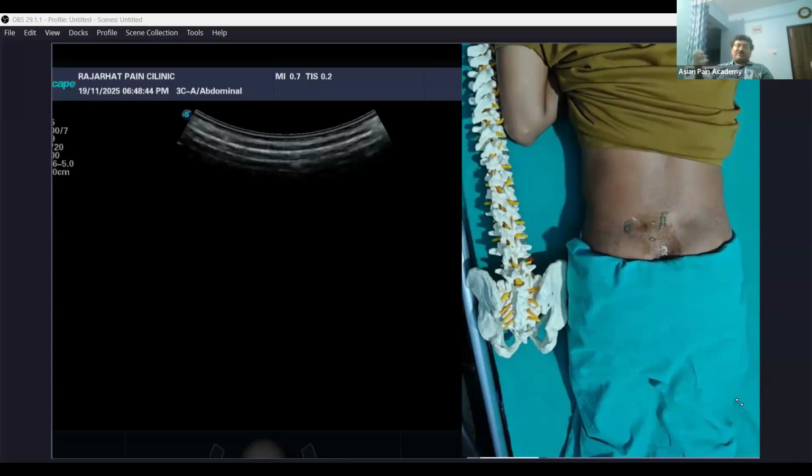usually we take 1.5 to 2 ml. But if accidentally you have taken a little more and you are not able to inject inside, you can give a pericapsular injection also. Remember, for the sacroiliac joint, sometimes the pericapsular injection also works. So in that way, initially you inject the maximum amount that you can inject within the joint without much resistance, and then come out slightly out of the capsule and inject the rest. It will also work. Okay.